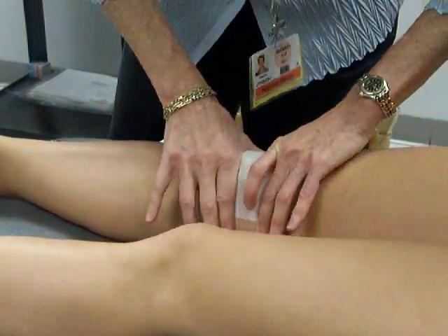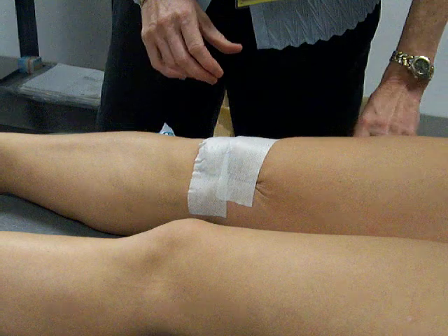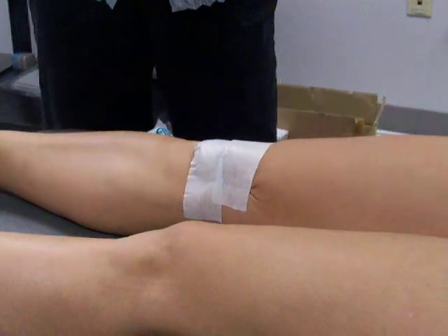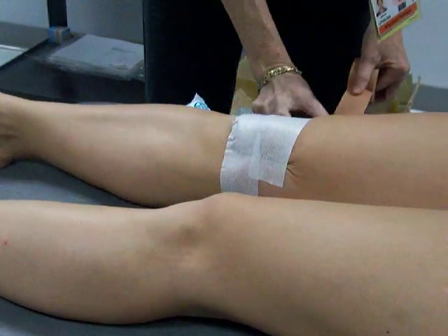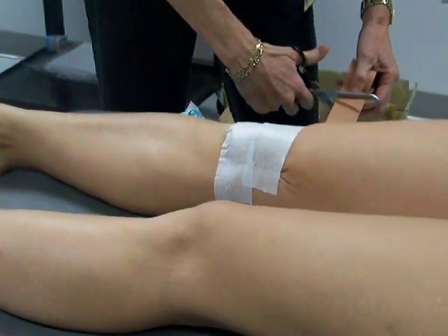PPL: push the kneecap over, pull the tape, lift the medial soft tissue. Then you do the exact same thing with your cover roll.